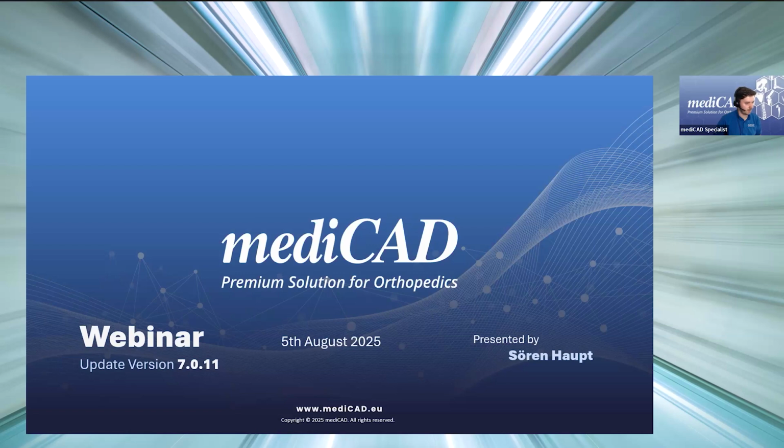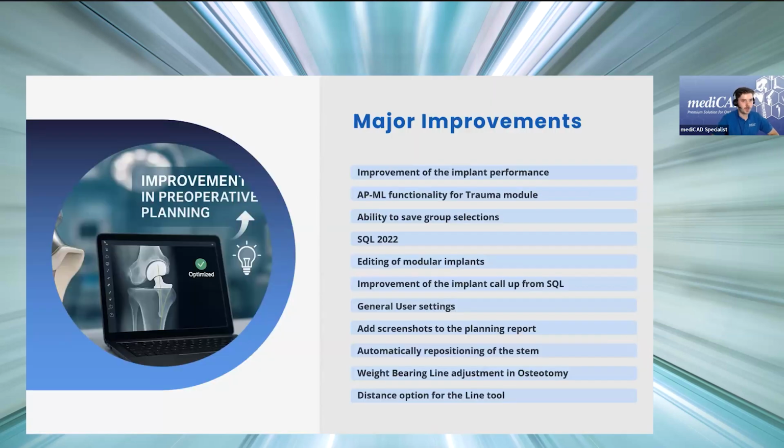Let's look at this update. The mediCAD 7.0.11. So this is the last, or this probably will be the last update in the mediCAD 7.0 cycle. This is obviously for every customer of the 7.0 free of charge, so no extra cost. Once the update is live, you or probably more your IT can download the update and install it right away. Maybe not in every case right away, but the installation with this update is also not that complicated. It's just a minor update in the 7.0 cycle, so it's a simple installation.